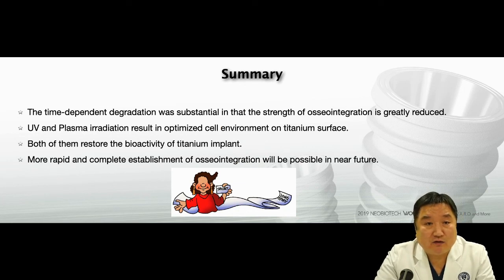Time-dependent degradation was substantial in that the strength of osseointegration is greatly reduced compared with a newly prepared titanium surface. So I shared with you some of my studies that were done with UV and plasma. Both UV and plasma irradiation result in a very optimized cell environment on the titanium surface.